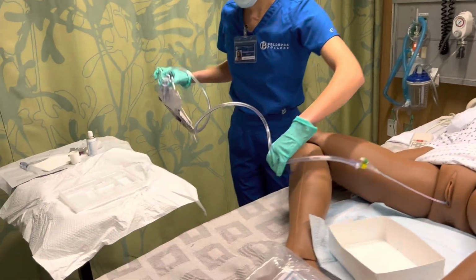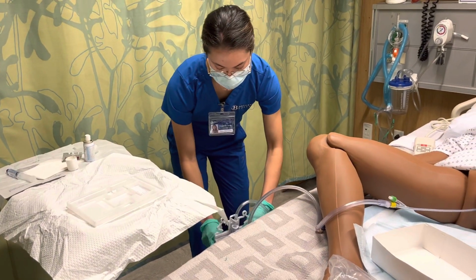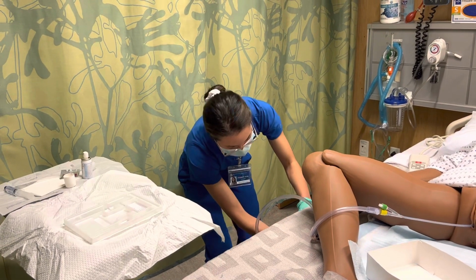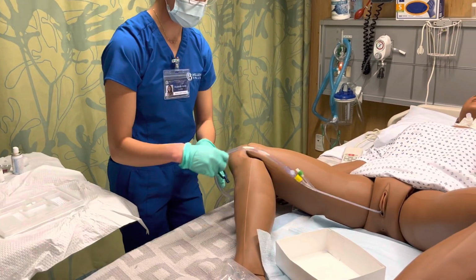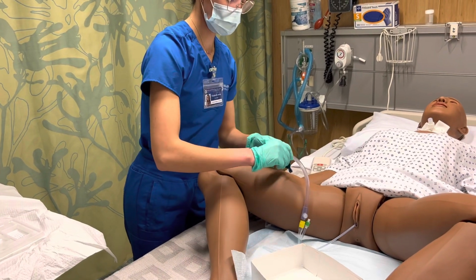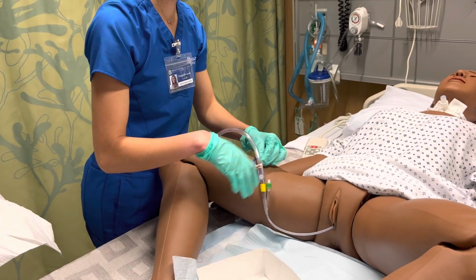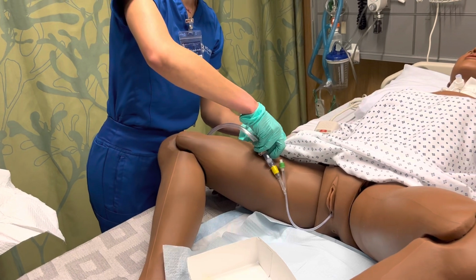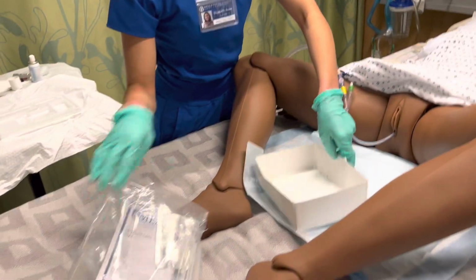So we'll hang this low on the bed. I will use this blanket to cover. Make sure there are no kinks in there. And we'll secure this. I could use a leg strap if those were available to me. We'll just use this clip for now. Okay, so let me get rid of all of this stuff.